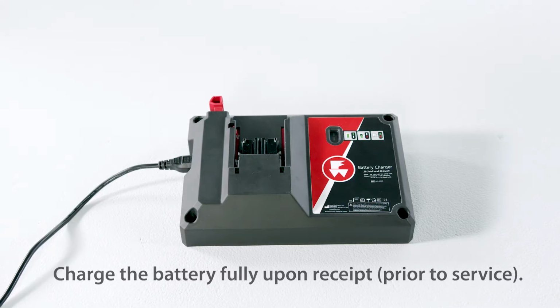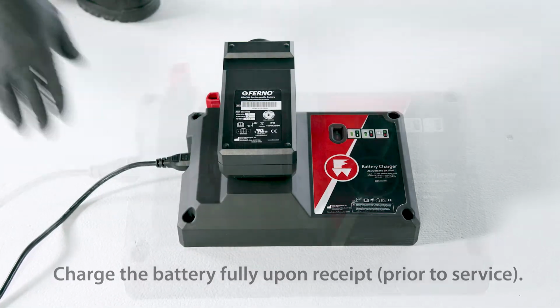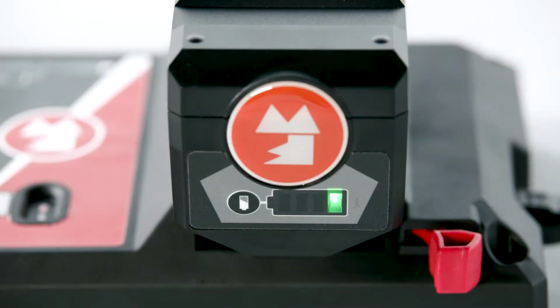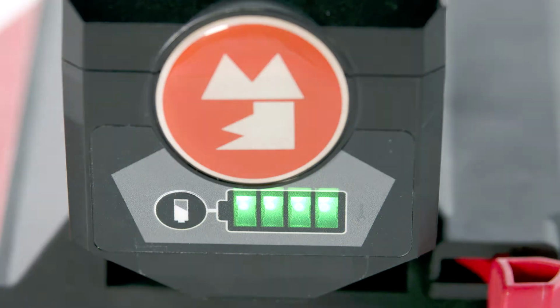Plug the FERNO AC charger into a wall outlet. Slide the battery connector into the battery port until the contacts are fully seated. During charging, a flashing green light indicates the battery is being charged. Solid lights indicate the level of charge in the battery.